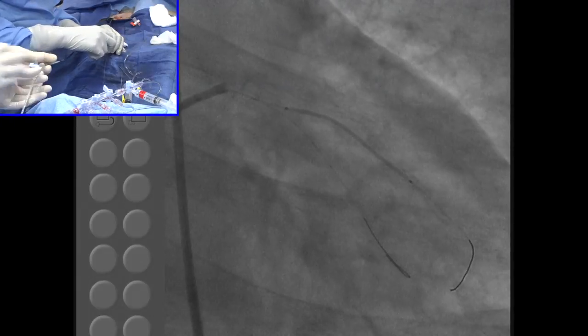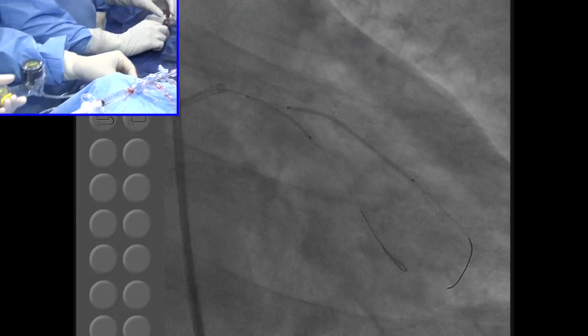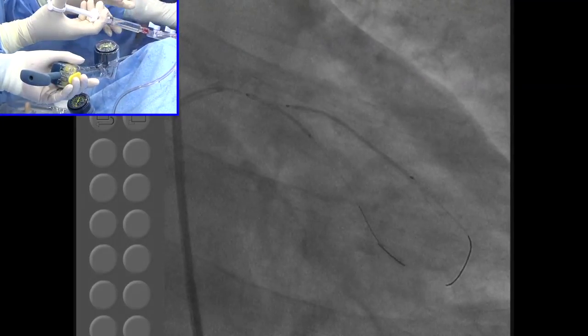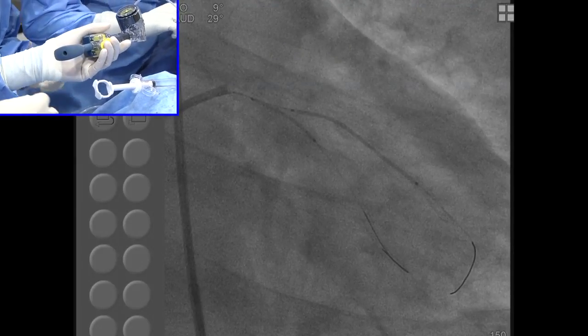Outside the US, which is the longest stent available? I thought it was only 48. No, I think there is a 60 also. Yeah. Okay, then take a picture with some dye. No, we see that there's a gap. Yeah. Good. This is what? This is the 38? Yeah.